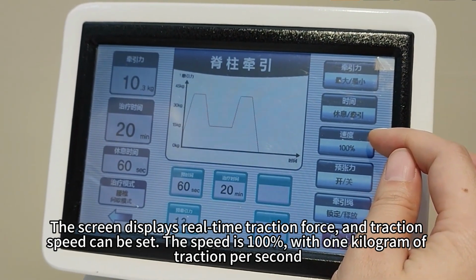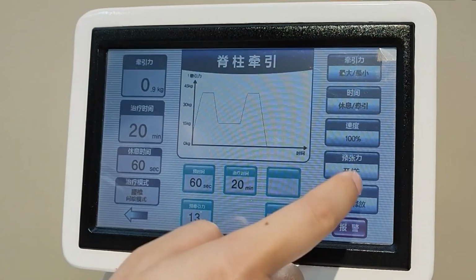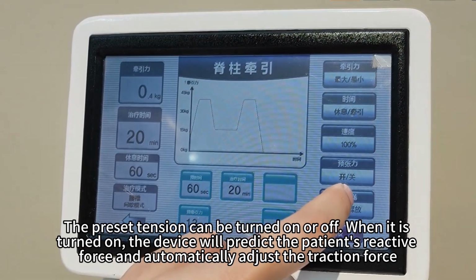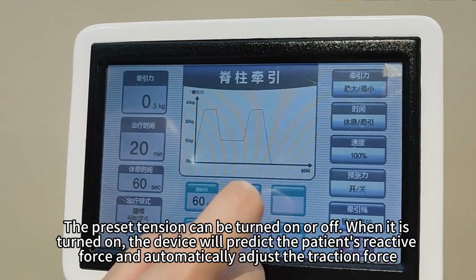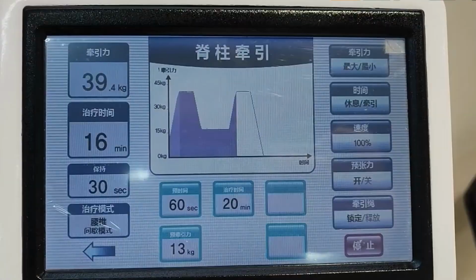The speed is 100%, with 1 kilogram of traction per second. The preset tension can be turned on or off. When it is turned on, the device will predict the patient's reactive force and automatically adjust the traction force.